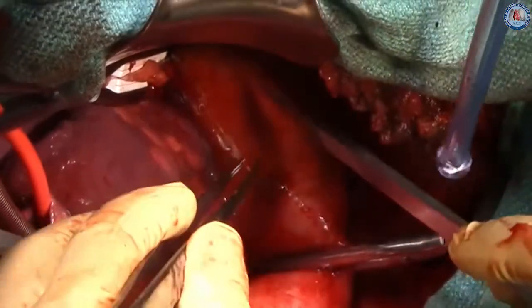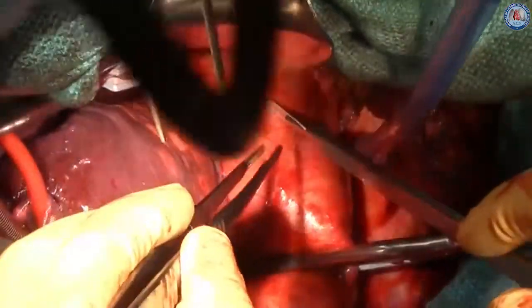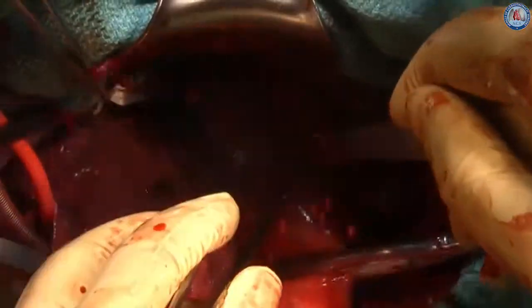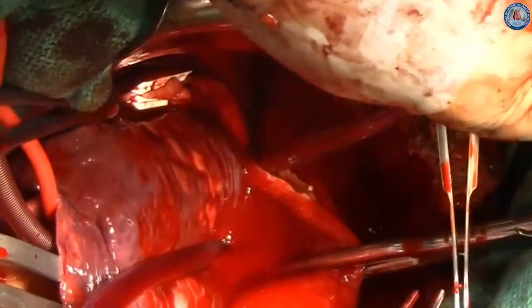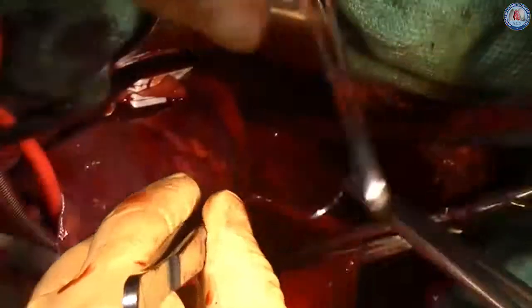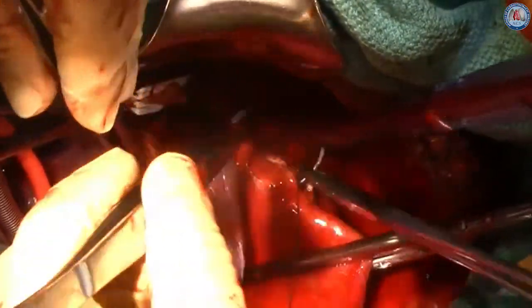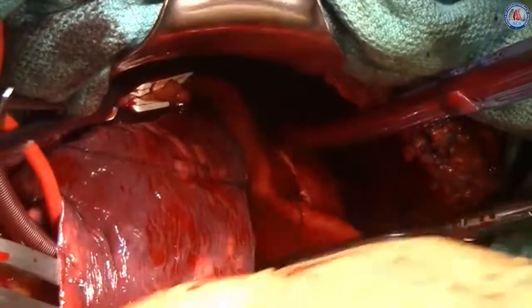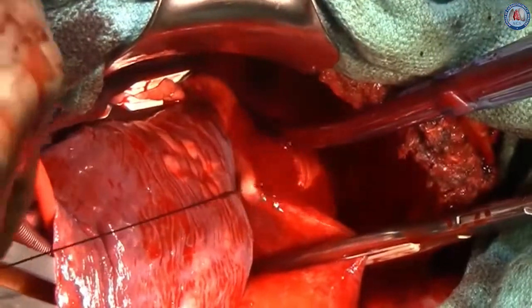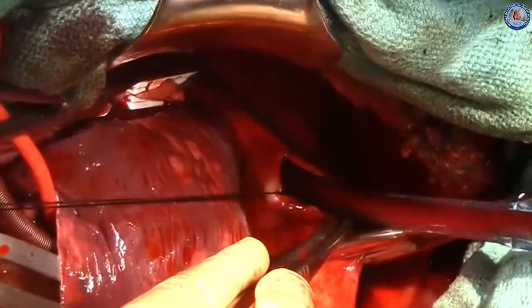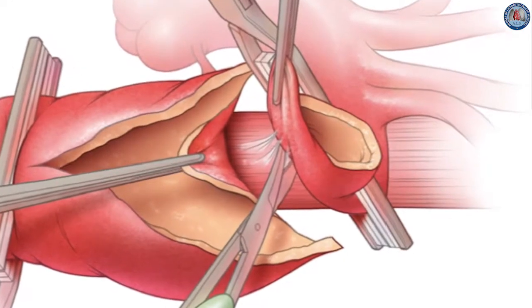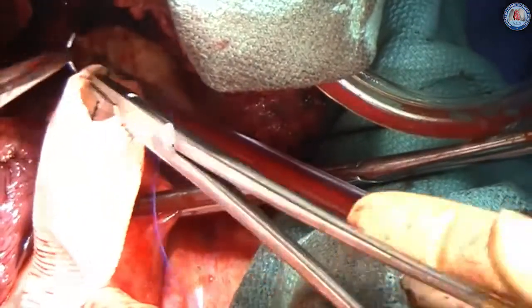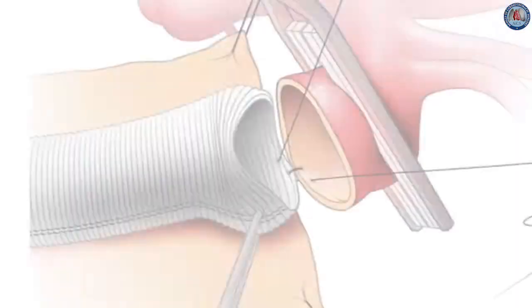The descending thoracic aorta is now opened and the chronic dissection exposed. Heavy silk stay sutures are applied to expose the aneurysm. The inclusion technique is avoided by separating the proximal descending thoracic aorta from the esophagus. The proximal anastomosis is now performed using a running 3-0 polypropylene suture.